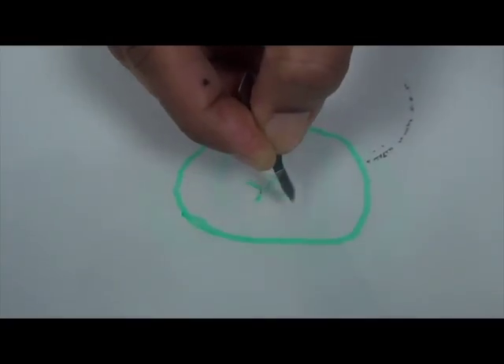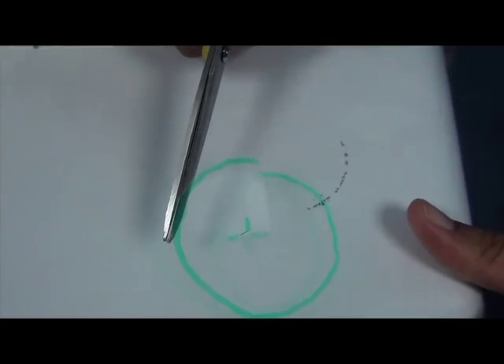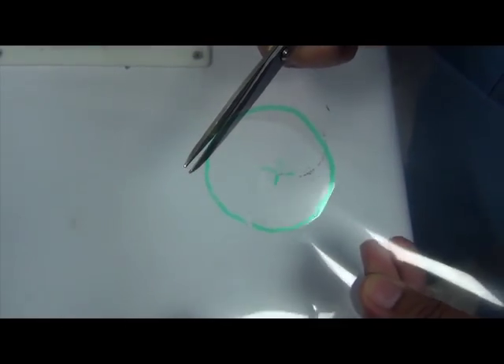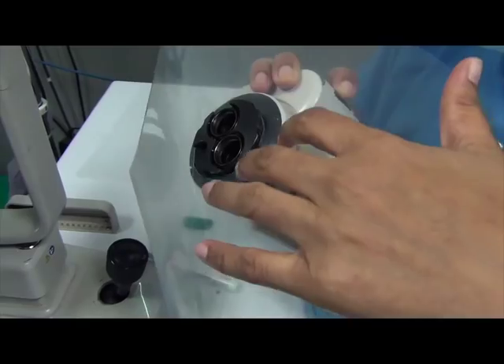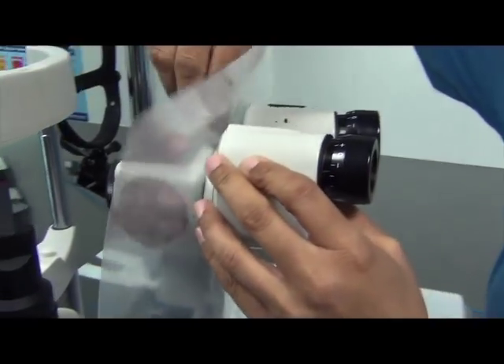Make a small cut on the marked circle with a blade, then cut all around with a scissor so that you get a hole in the sheet. This is now placed around the eyepiece that was disconnected, and the eyepiece is screwed back onto the rest of the slit lamp.